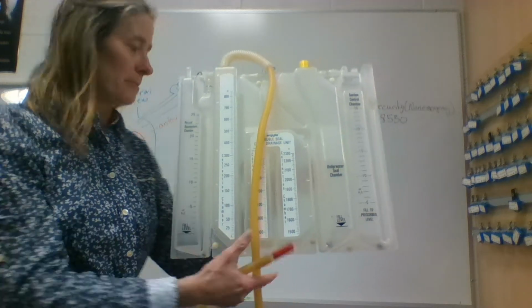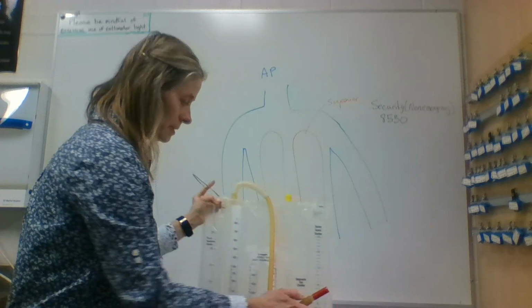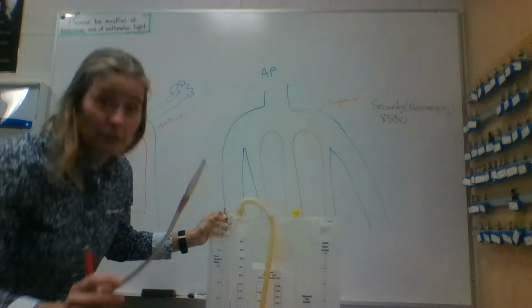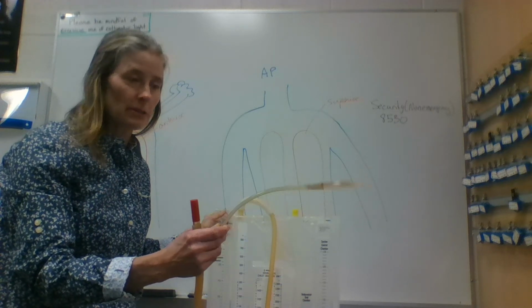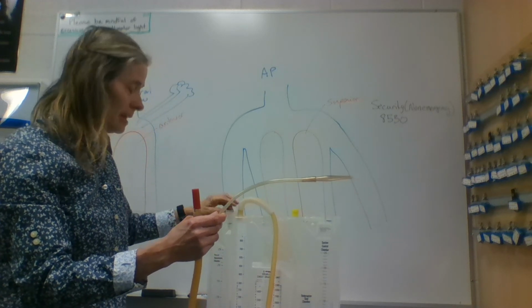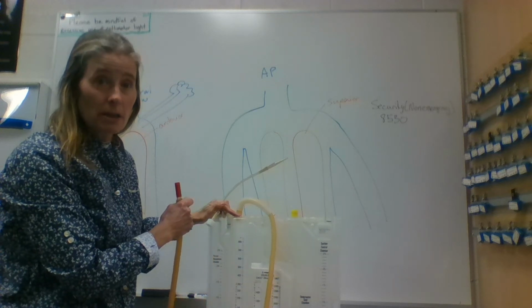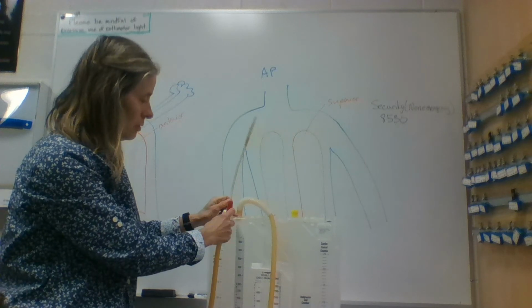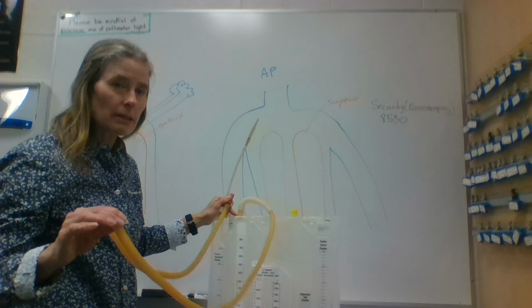So this is something that we would come across now after the x-ray has been done. So the insertion tube, and I have one here, for example. This is a flexible tube. So the big needle part would come out. This is the flexible tube that would be left in the patient. And it's transparent too, so we can see if we're collecting blood or what have you. It would be hooked up to this tubing here.